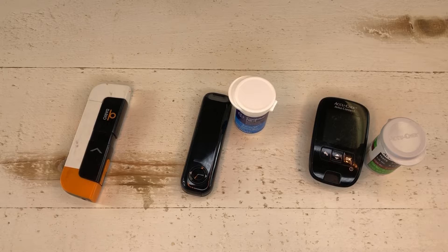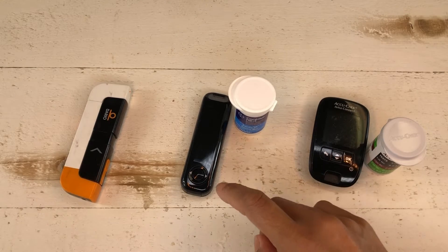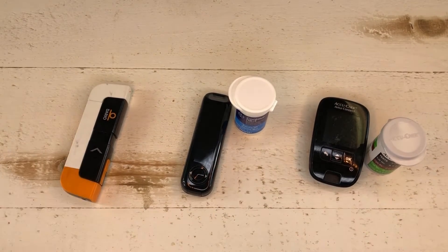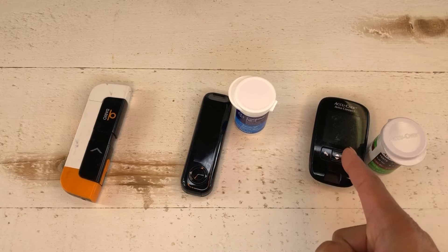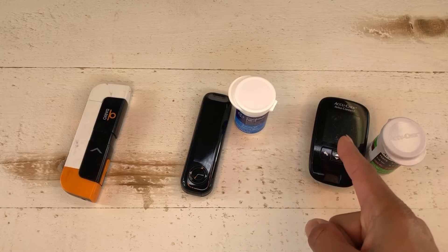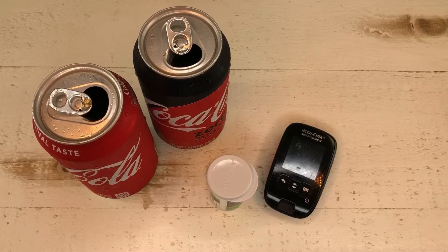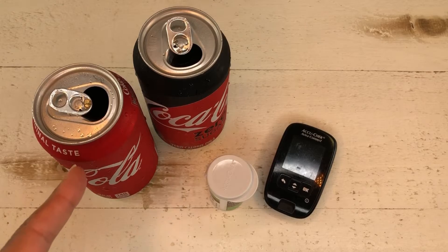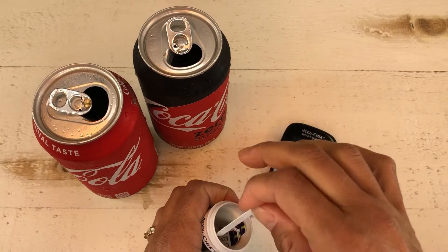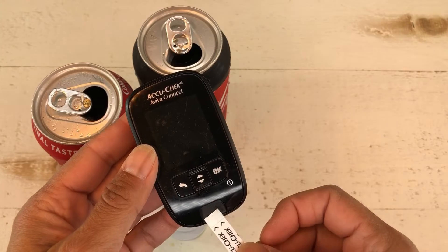These are the three meters I currently have that are working: I have a Roche AccuChek, I have an Essentia Contour Next, and I have my Dario meter. My Dario is my primary meter. I've used the AccuChek before for testing sugar-free drinks and I know that one works, so let's start with that. I've opened a regular Coke and a Coke Zero, so obviously we know which one is which - but let's just test it anyway.